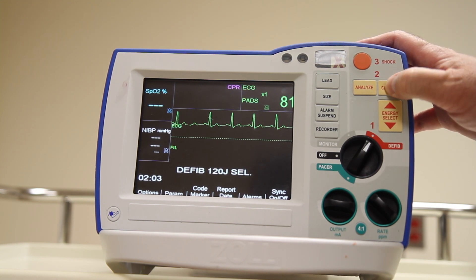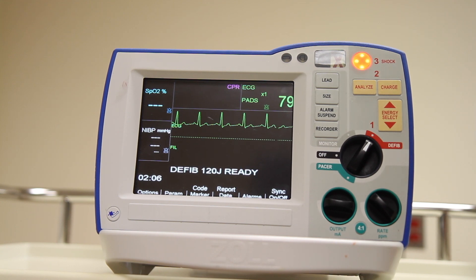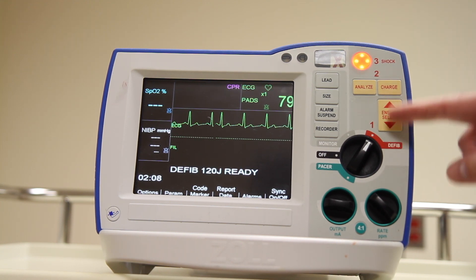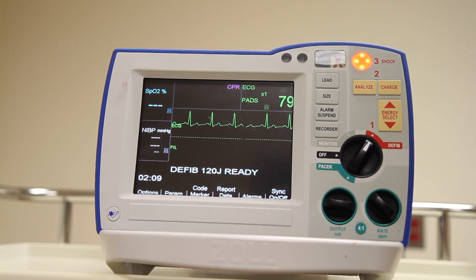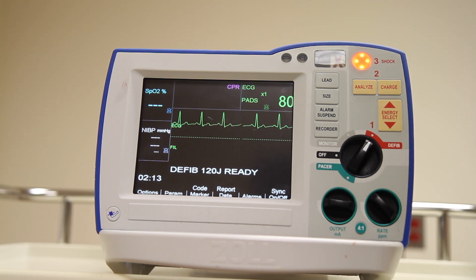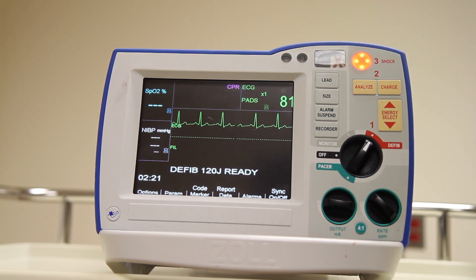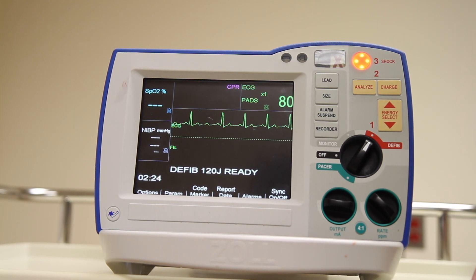Moving up on the right side of the device is the charge button. When I press the charge button, it's going to charge up to the energy setting I selected using the up and down arrows. When it is ready, a red light and an audible tone will occur, letting you know that the device can be discharged. At that point I would either defibrillate the patient or dump the charge by switching it out of defibrillator mode.